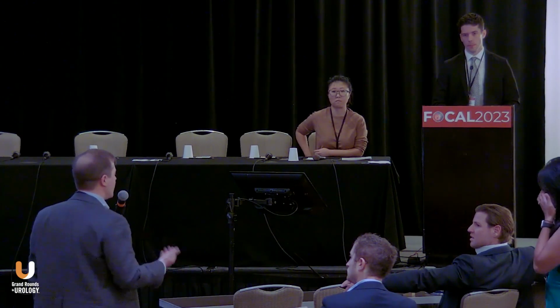Thanks, Professor Trigger. That's a great question. It's not so much the inadequacy, and you are correct. I get patient referrals who've had a standard of care biopsy, and before I'm ready to take them into a partial gland treatment pathway, often I have some reservations as to the accuracy of the biopsy. As we know, there's a lot of inaccuracies in MRI reads, there's a lot of inaccuracies in targeted biopsy. A 12-core plus a targeted biopsy remains our accepted standard for patient selection. What I worry about and what I've seen in early data is that occult contralateral grade 2 disease, and that's an early candidate failure. What we see here is about a 20% rate. That is the same as what whole gland evaluations of candidates would be, and I think it mimics a lot of what we saw from your PSMA work as well.